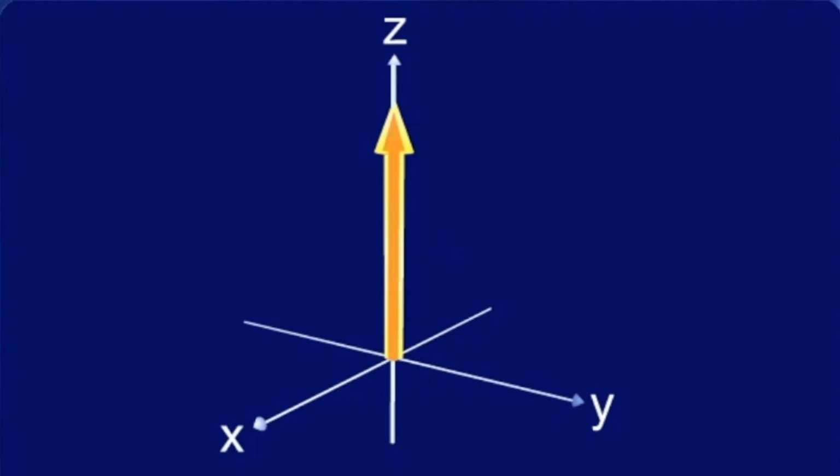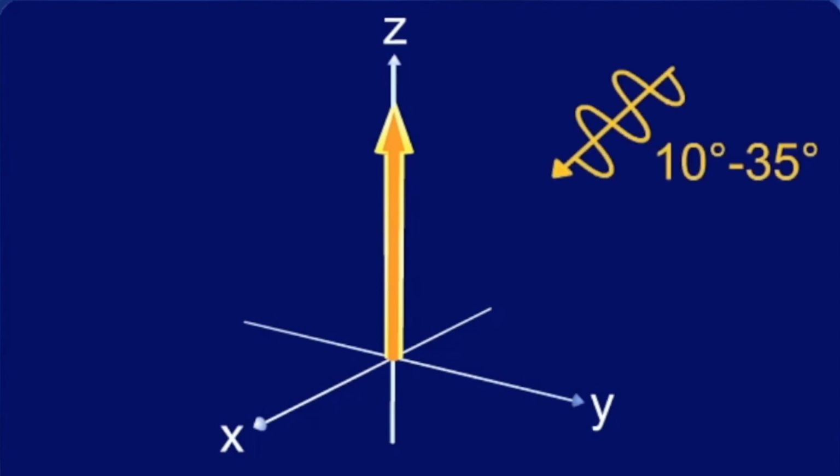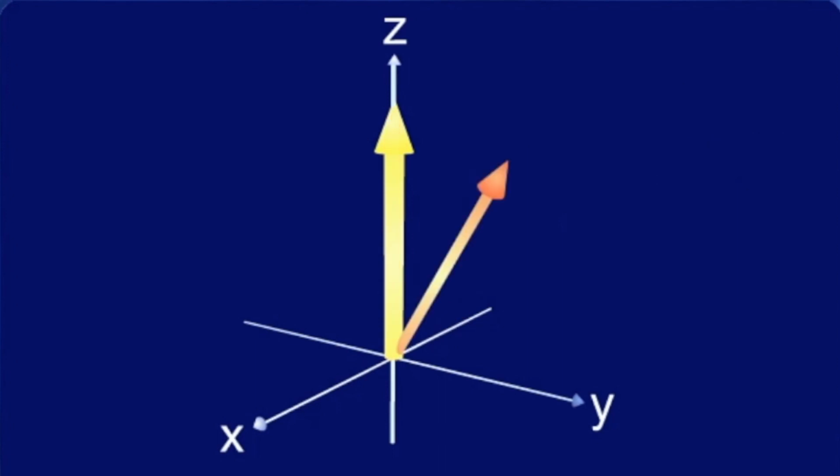The trick with the fast imaging sequences is not to use a 90-degree pulse, but pulses that cause smaller flip angles, mostly in the range between 10 and 35 degrees. With these flip angles, smaller than 90 degrees, longitudinal magnetization is not totally abolished. Instead, there is always a substantial amount of longitudinal magnetization left, which can be tilted by the next pulse. This gives a reasonable signal even if the next pulse comes in after a very short TR.